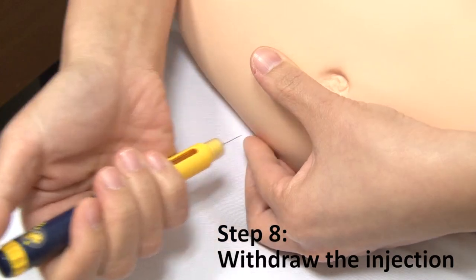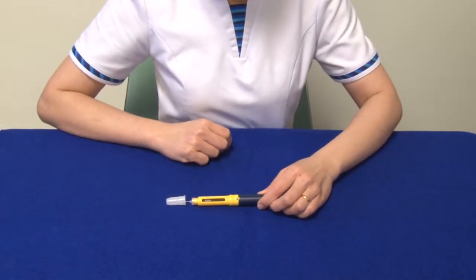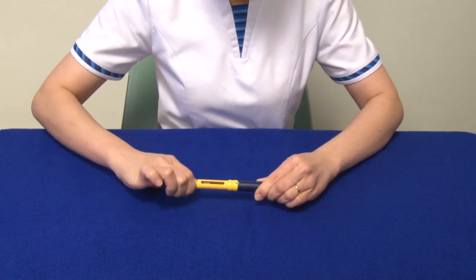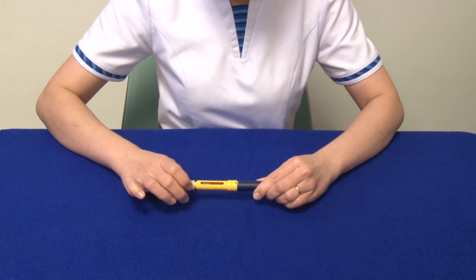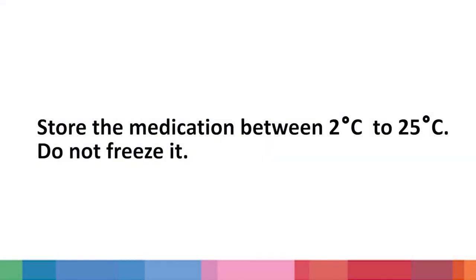Step 8: Withdraw the injection. Use an alcohol swab to apply light pressure and gently wipe the injected site. Replace the outer needle cap and unscrew the needle by turning it anti-clockwise. Discard it into the disposable container. Store the medication between 2 degrees Celsius and 25 degrees Celsius. Do not freeze it.